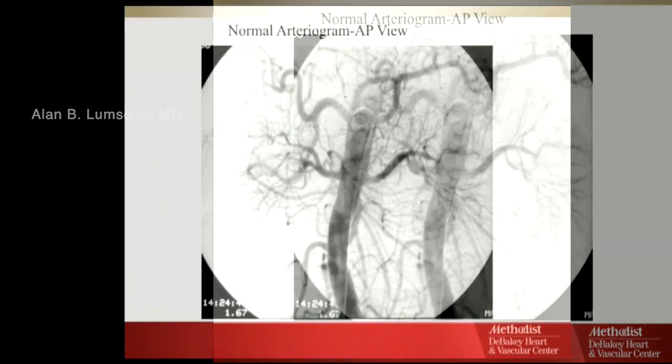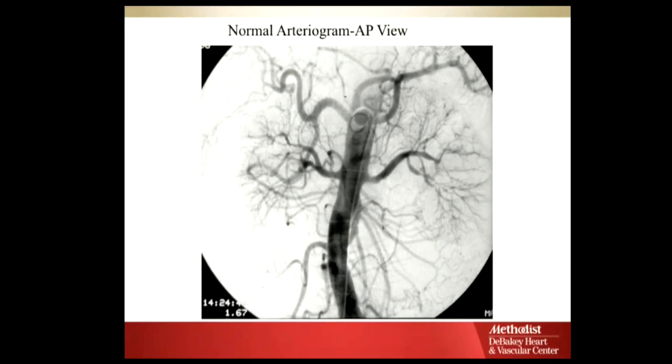Left renal. Jejunal branches, okay. So again, hard to tell because you can't see the SMA. Why can't you see the SMA? Because you're looking straight on top of it. So the SMA is going to be coming out here. You just can't see it. It drops along the front of the artery. You still can't see it. It angles off to the side just a little bit. These are all branches coming off the SMA.